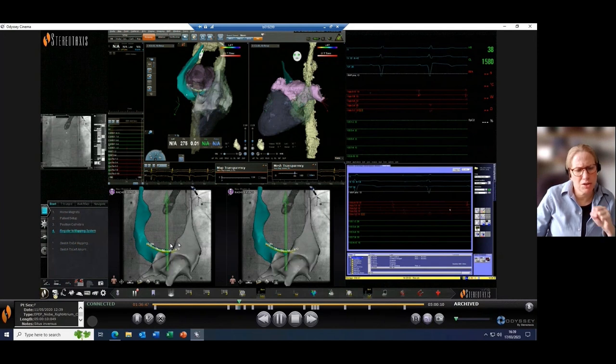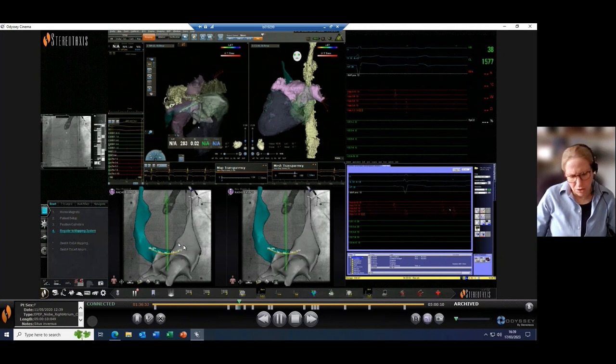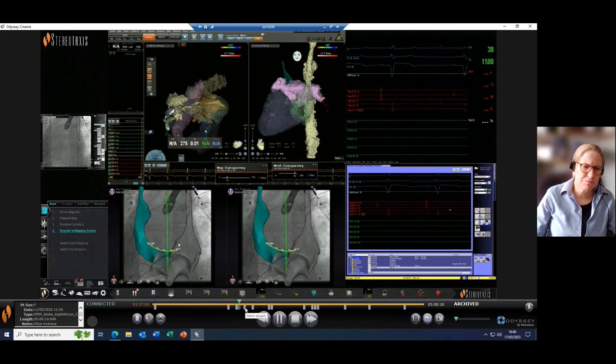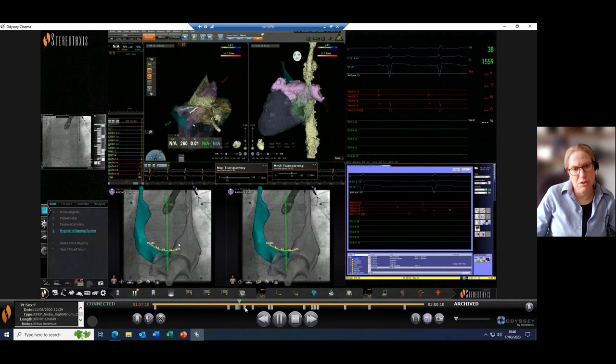It's not about mechanical pressure. You basically burn through the septum. And that's my go-to technique when I do congenital patients, puncturing through patches and so on. And in fact, the trick of visualization of the needle tip, as you can see here, or you'll see in a moment, on the CARTO system is nice. It allows for zero fluoro even in normal patients. So that's my typical CARTO zero fluoro approach for atrial fibrillation patients.